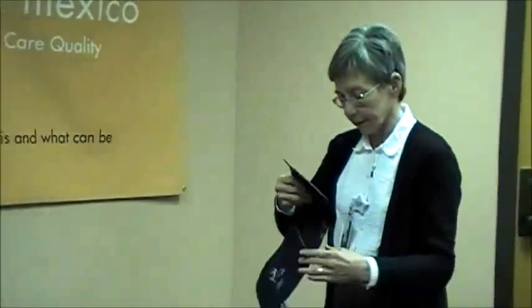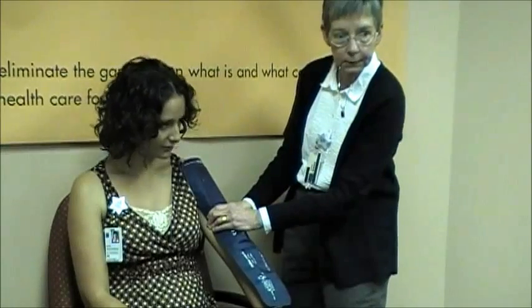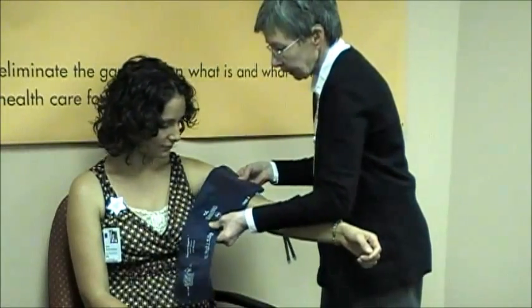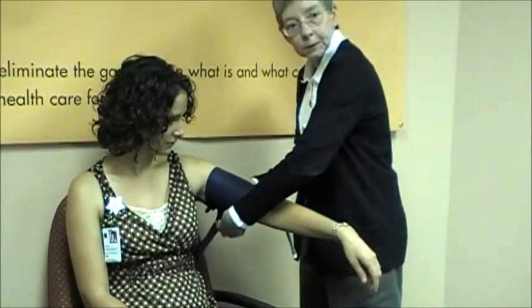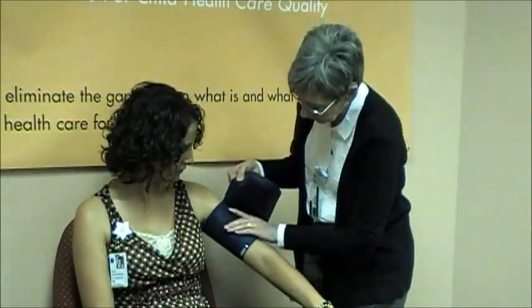Kirsten is going to be a more appropriate candidate for a standard adult cuff. In this case, the bladder does cover approximately 50 percent, and the bladder circumference is certainly 80 percent and a little less than 100 percent of her arm circumference.